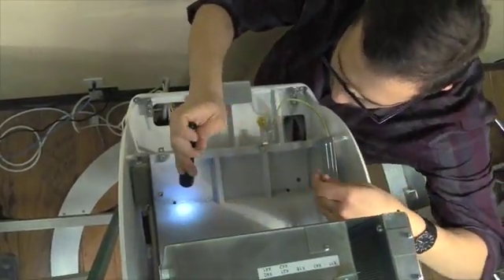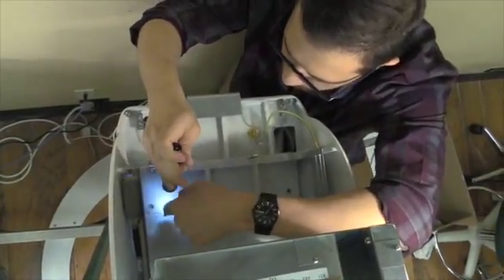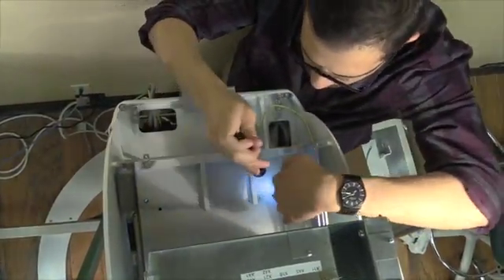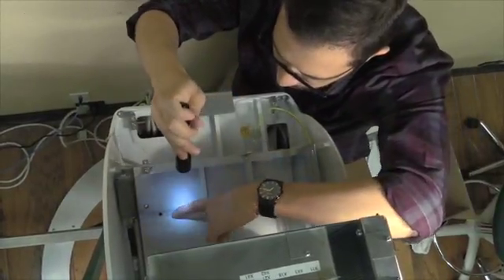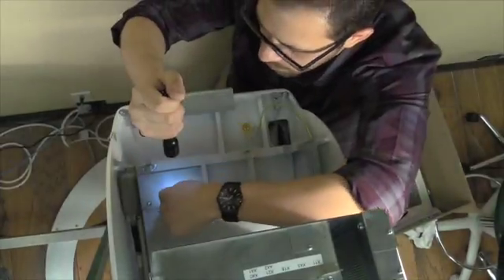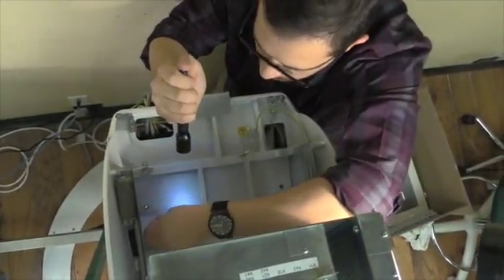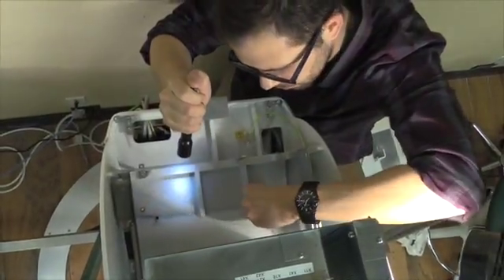And what's important here is you want to make sure that the actual pins will fit and go into the column, because that's the way it's meant and put together in the factory. So in the factory, when they calibrate the system, they drill holes into the rotator, and that's the purpose of placing these two locking pins. And we place locking pin number 1, locking pin number 2.